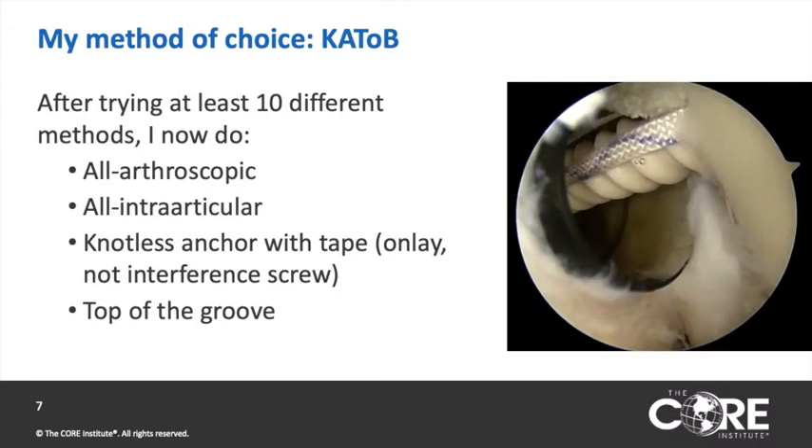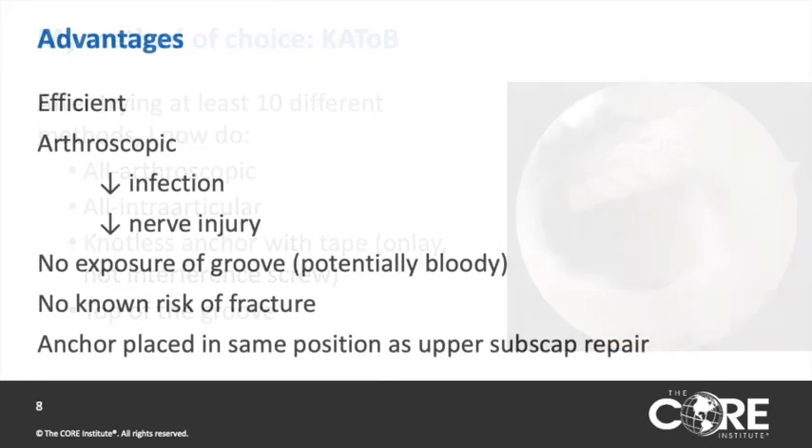As a result of many of these issues, I now use the KAToB technique, which is a knotless, all-arthroscopic, intra-articular tenodesis of the biceps done at the top of the groove using a knotless anchor. It's efficient, and because it's arthroscopic, it has a lower risk of infection and lower risk of nerve injury. There is no exposure of the bicipital groove, which can be bloody arthroscopically, and there is no known risk of fracture with anchors in this area. This is the same location that an anchor goes for an upper subscapularis repair.